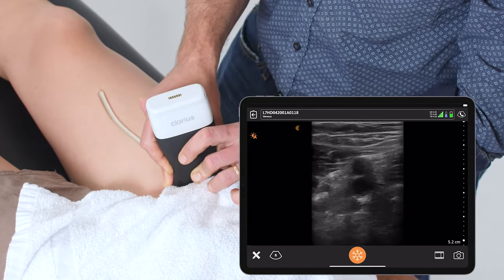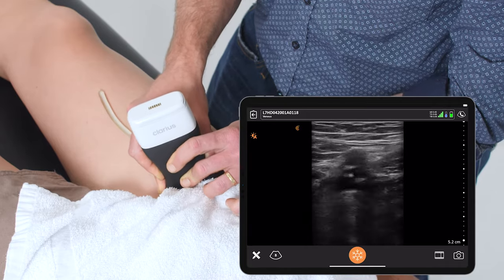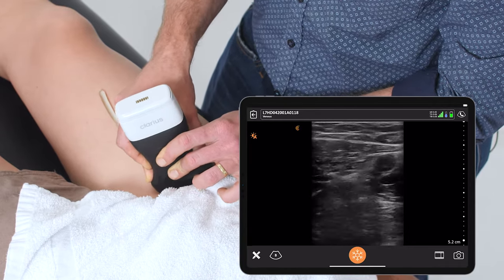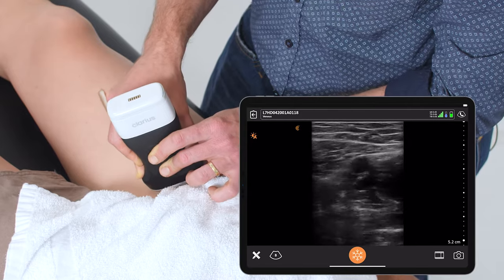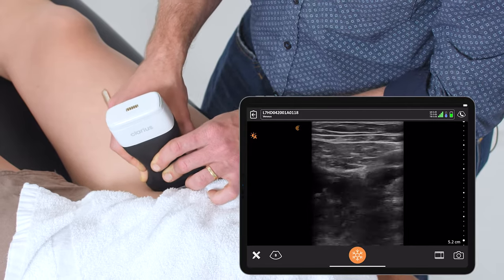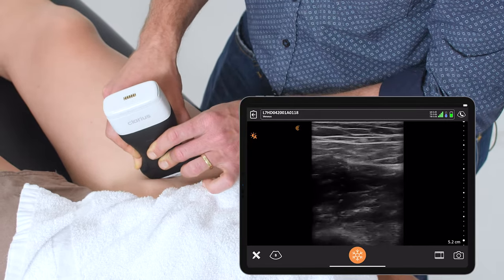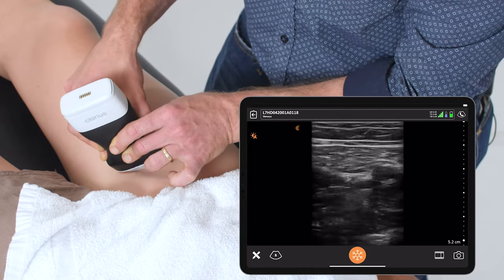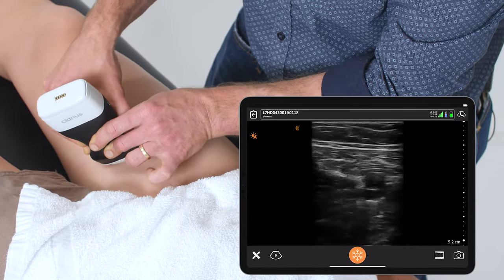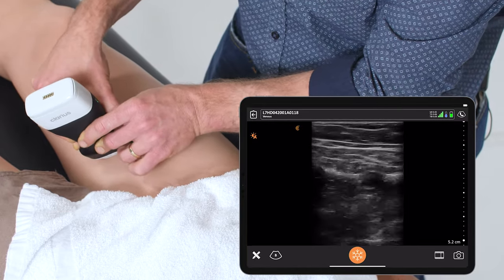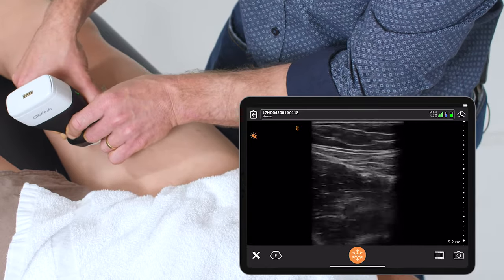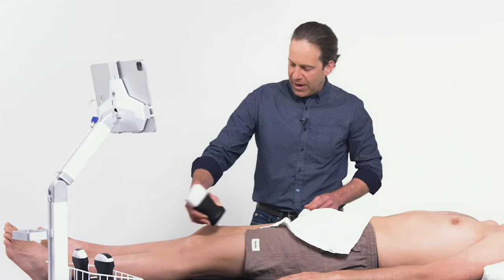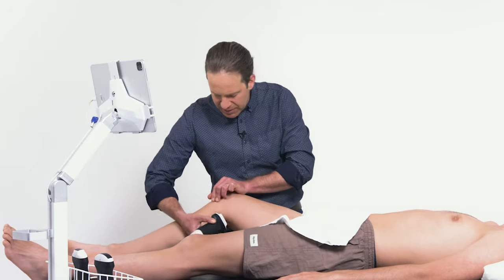I'm repeating this as I go down the adductor canal, every few centimeters compressing, until I lose sight of the vein, and then I'll move into the popliteal fossa.